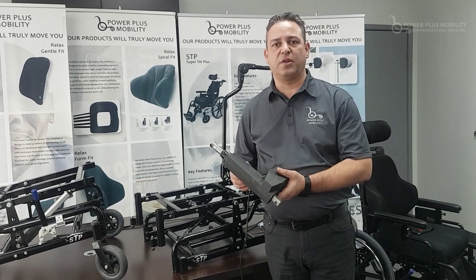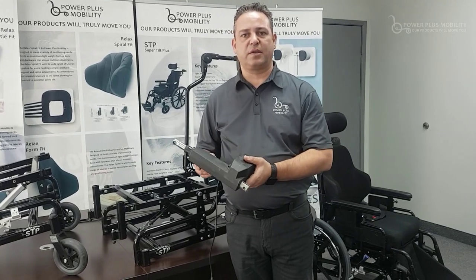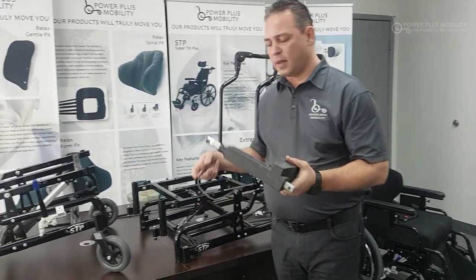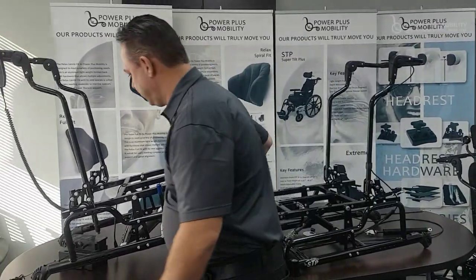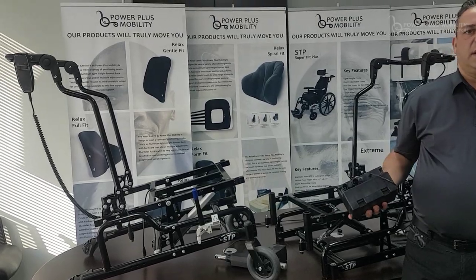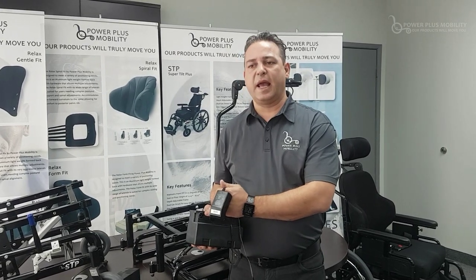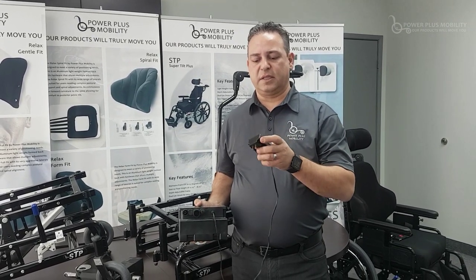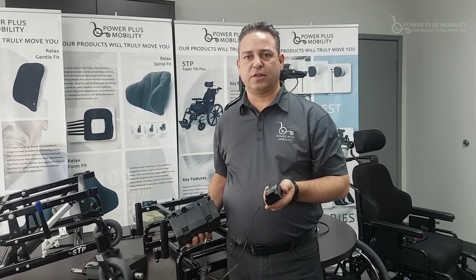This type of cylinder requires customization on our STP or Extreme — we'd have to weld additional mounts on the chair. This cannot be retrofitted in the field and would have to be ordered factory direct from Power Plus. Alongside the cylinder, there are two other components that come with it. One is the battery pack, into which the cylinder module plugs directly, and it also plugs into the hand control device.